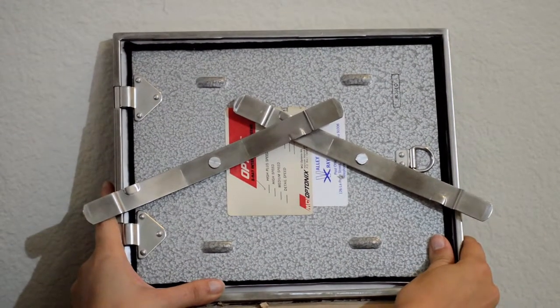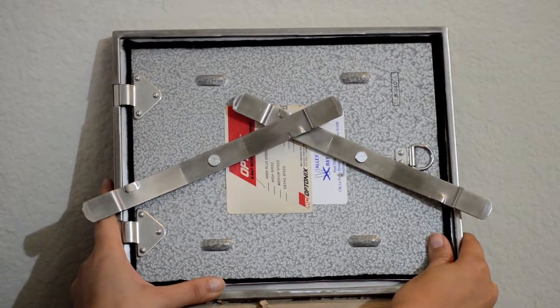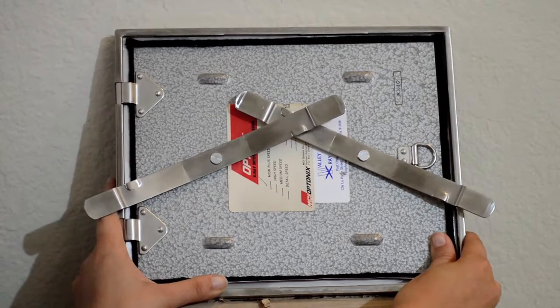Issues with any aspect of what was discussed will lead to image artifacts, crossover, and/or image noise. Screens should be cleaned once each month with a manufacturer's cleaner with anti-static compounds to help ensure a clean image.